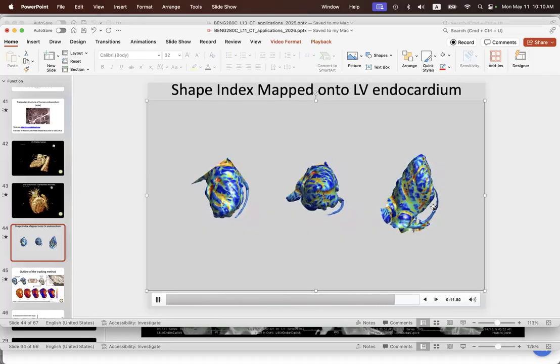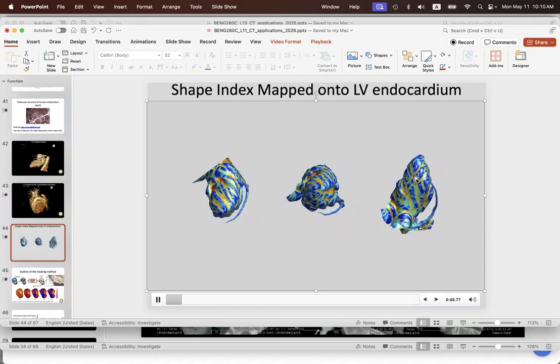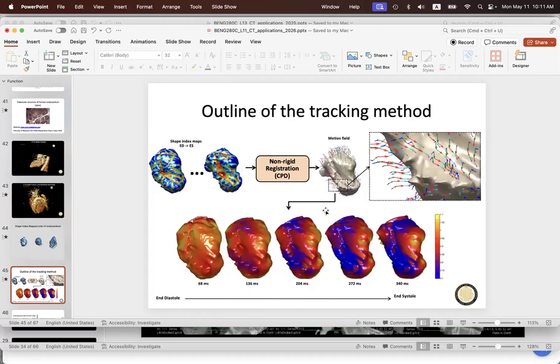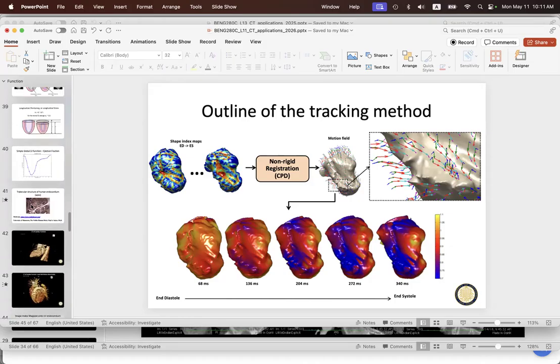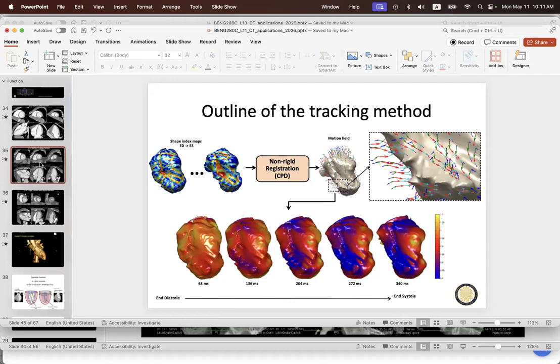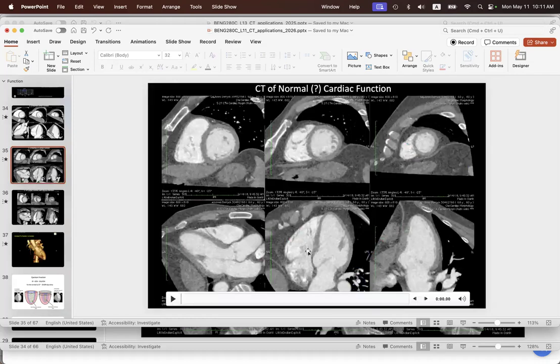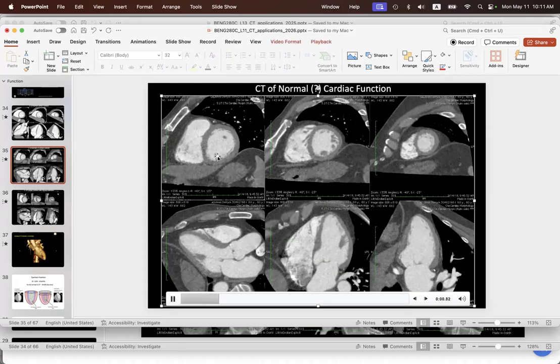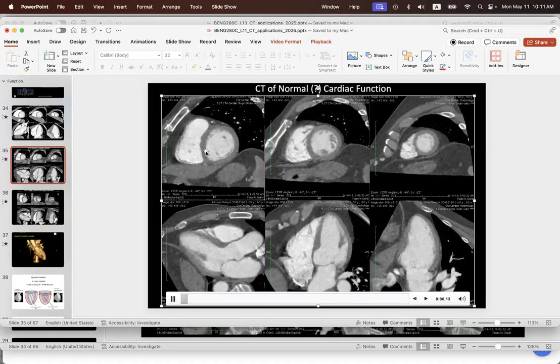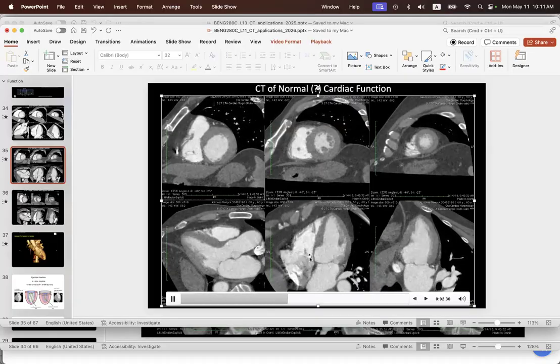This gives us a really clean signal for measuring local contraction, right? As you saw in the abnormalities that we looked at above, left ventricular abnormalities come in forms where they're very local, right? So this one was really local. It was only this little position here. The rest of the ventricle is doing fine, but right there we got a problem. Right here we have a problem.